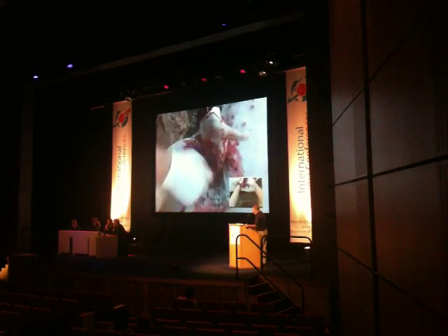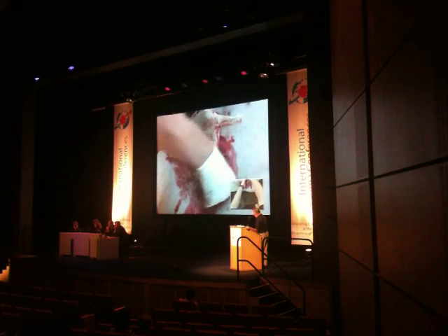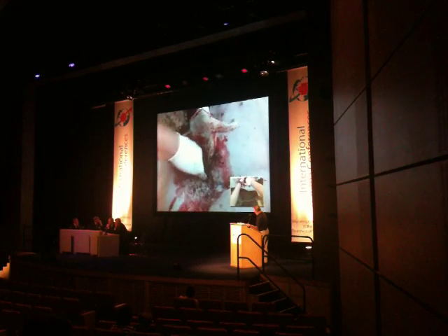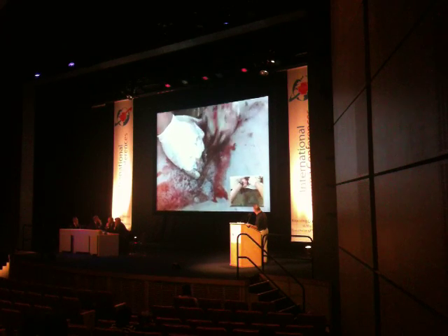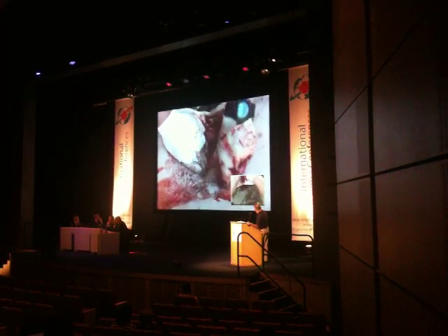The important thing about this video is that there is absolutely no time delay — this is at real time. From beginning to end you're seeing the entire process without any skips in the sequence. He is packing the wound stat product down to the bottom of the wound bowl, covering the entire floor of the wound bowl with the product.